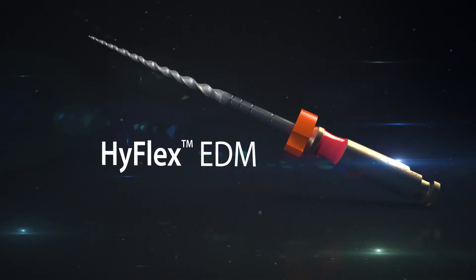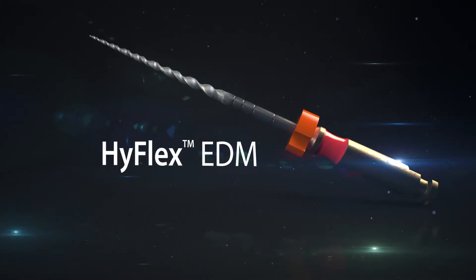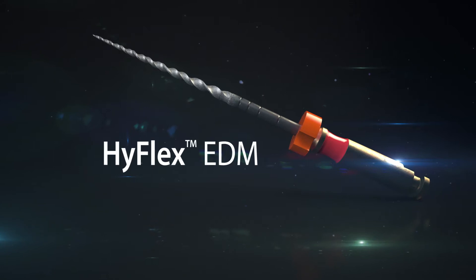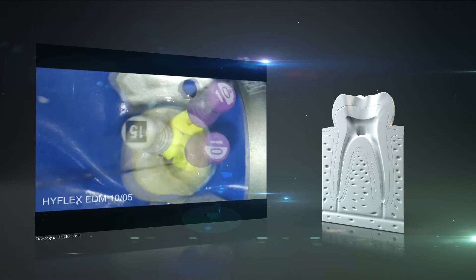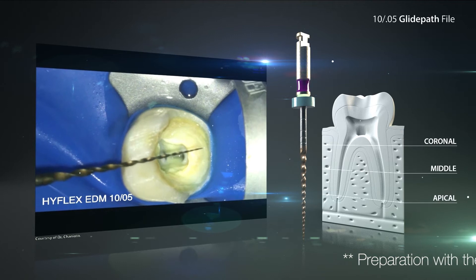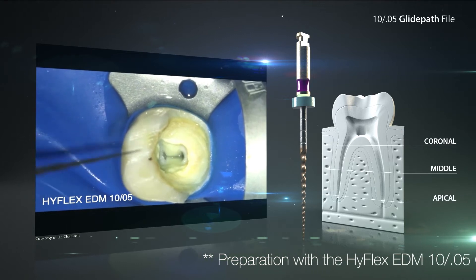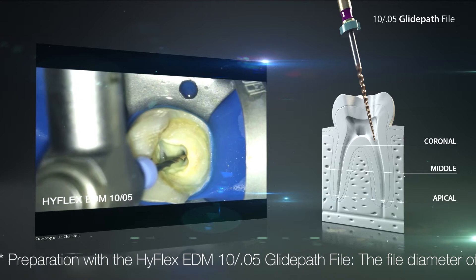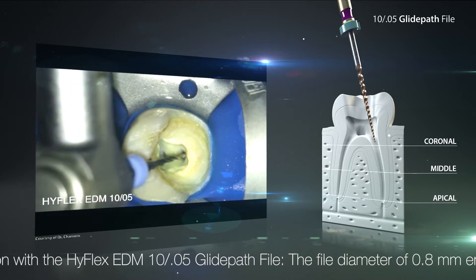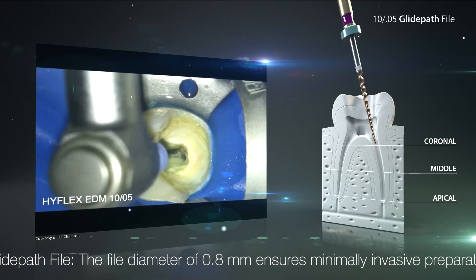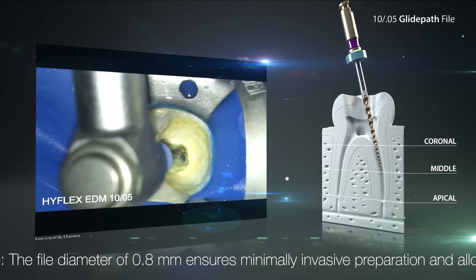The innovative HyFlex EDM offers the dental practitioner even more ease of mechanical preparation. The root canals in this case are slightly curved, so after creating the manual glide path initially, a rotating glide path will be created. For this, all root canals are prepared with the HyFlex EDM glide path file.